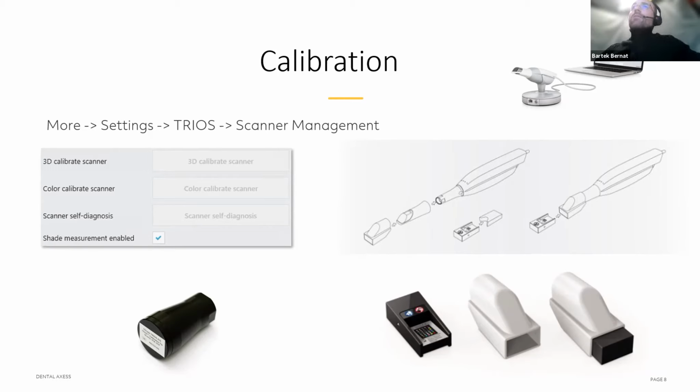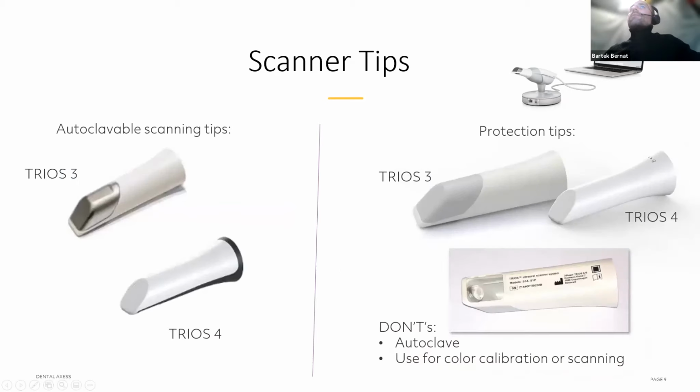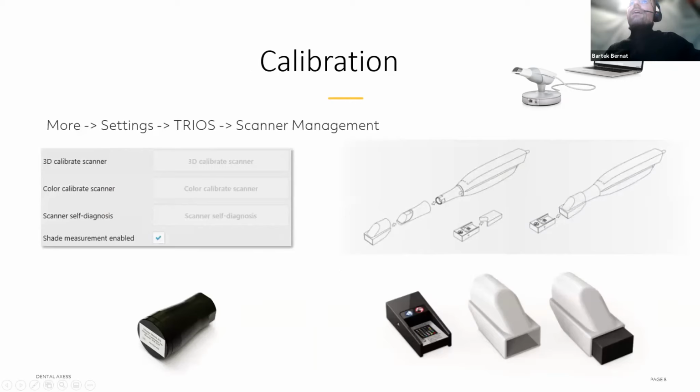Okay, so let me move to the other slide so that you can see the tips. This is the actual tips that you use. Those are the tips for the scanning, and those are the protection tips. So let's move back a bit here. One more thing I'd like to cover.